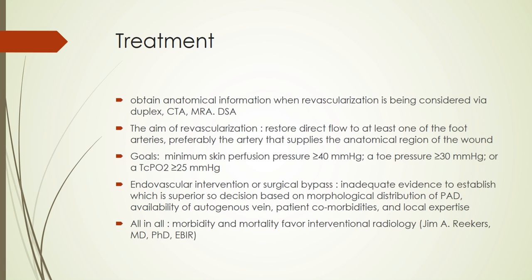In terms of treatment, before doing any revascularization procedure, we have to take anatomical information either by Doppler, CT angiography, MRA, or DSA. The aim of revascularization in these patients is to restore direct flow to at least one of the foot arteries, preferably in the arteries that supply the region where the ulcer is placed.